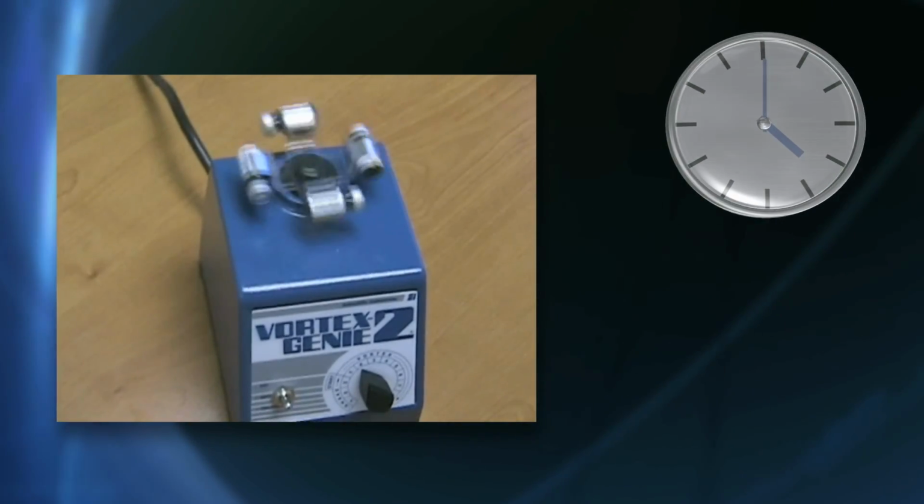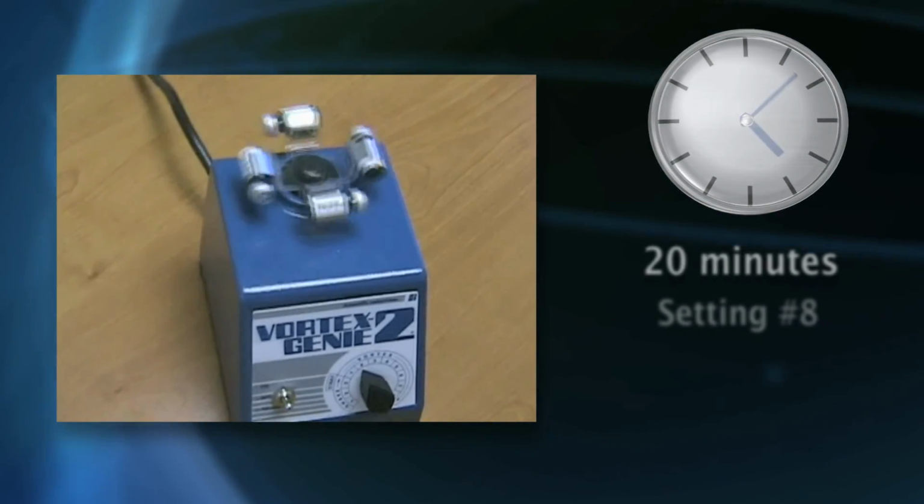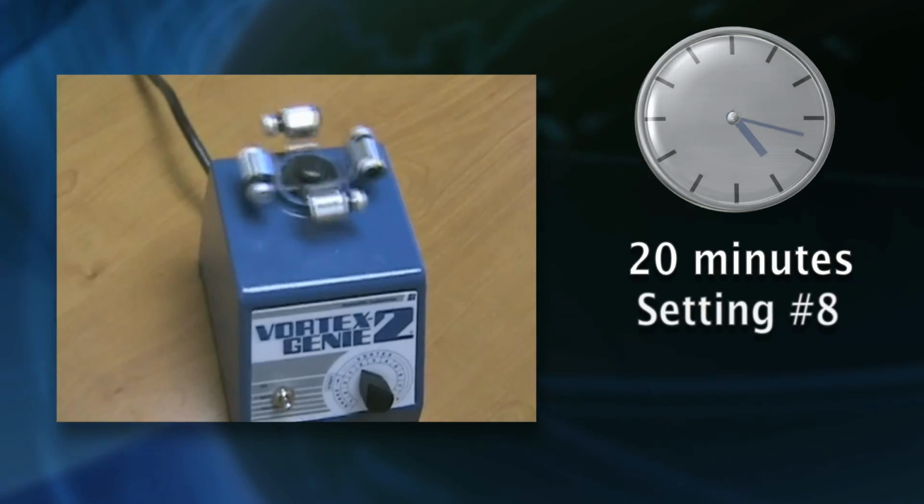Prior to injecting ONYX, load the ONYX mixer with 4 vials of ONYX and shake for at least 20 minutes at a setting of 8. Continue mixing until you are ready to embolize.